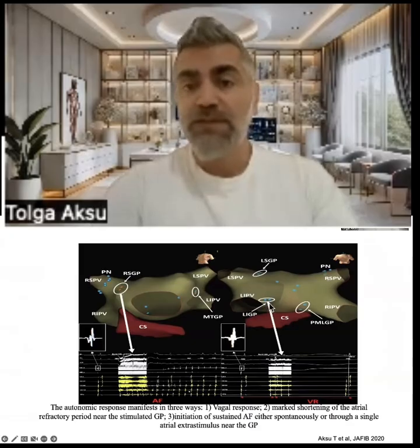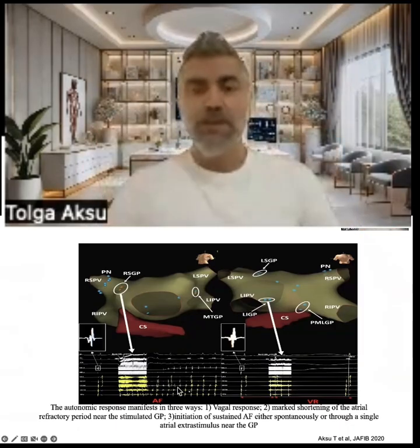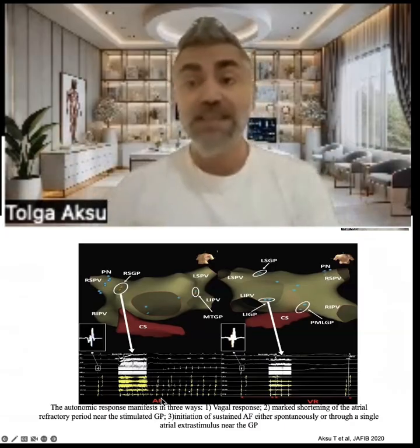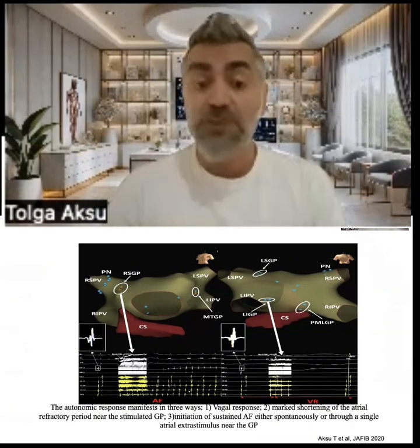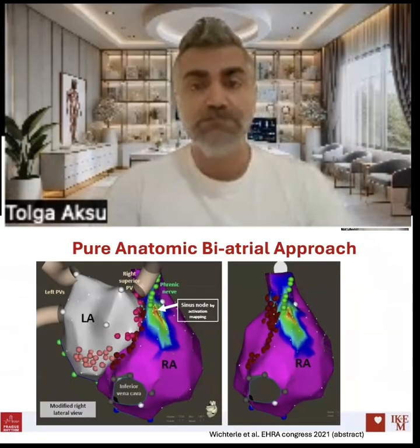But we are in left inferior GP area. Again, you are seeing very fragmented electrogram, very compatible with the left inferior GP. During high frequency stimulation, we are seeing a clear vagal response. I think that if you want to use high frequency stimulation and if you induce atrial fibrillation, you should accept it as another autonomic response. And you should say this is another vagal response. In other ways, you can miss the great majority of GP by using high frequency stimulation.